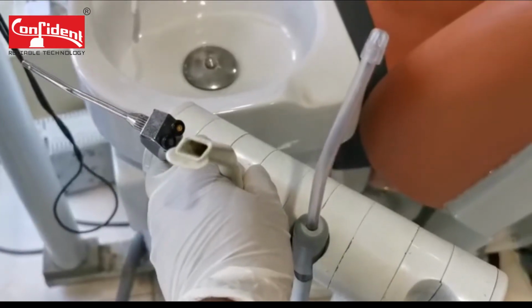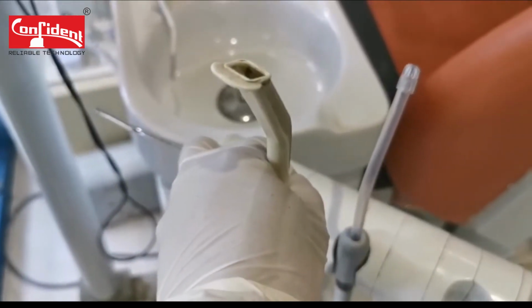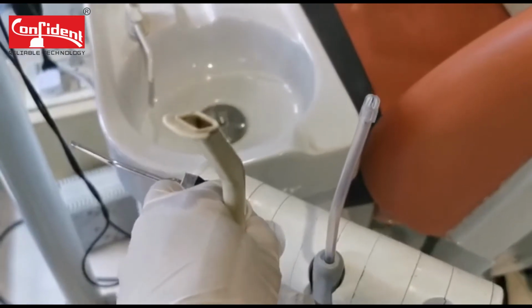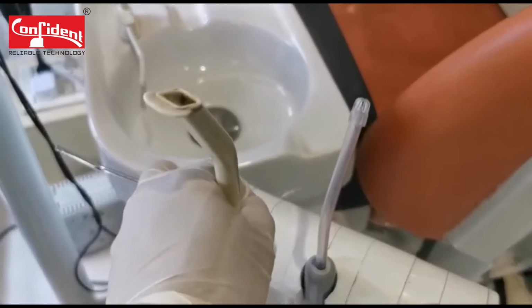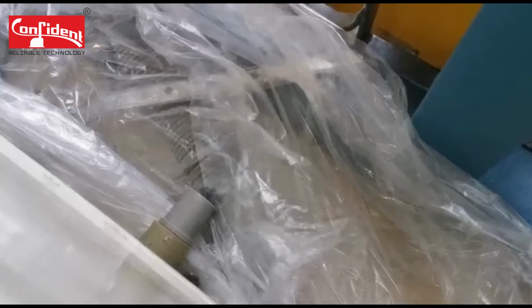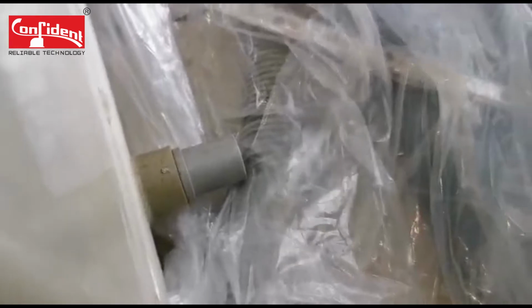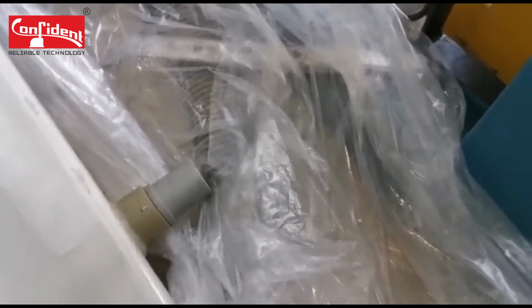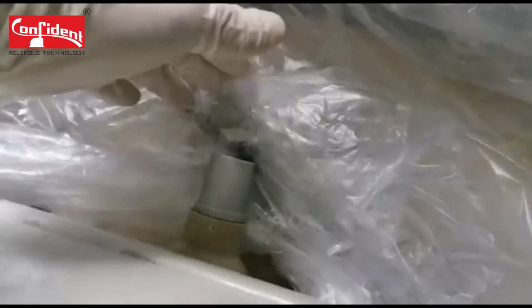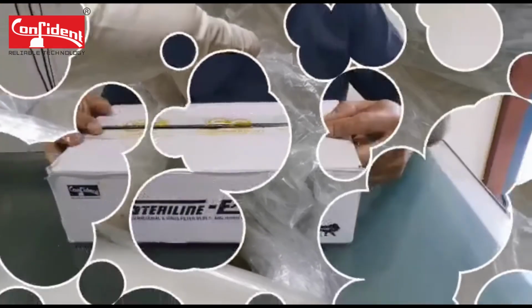To give you a demo of what I mean, when we remove the suction, as it runs there is an inflow of air and water. When this is being used, I will show you. The water gets ejected, but the air is coming through this silencer over here. Can you see the plastic sheet shaking because of the air coming out? So you can see the air coming out over here. This is ejected into the clinic.